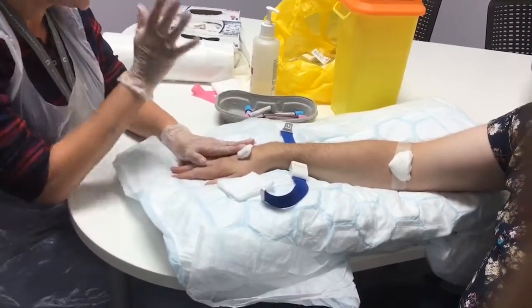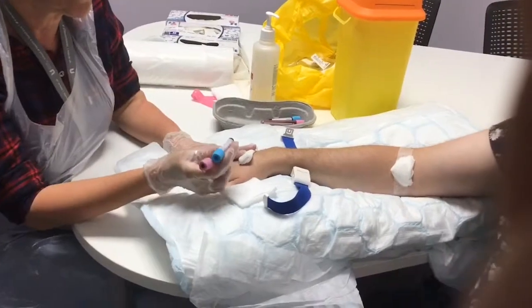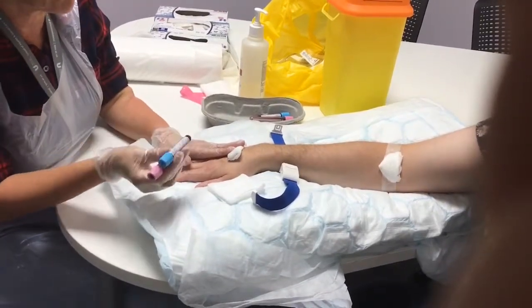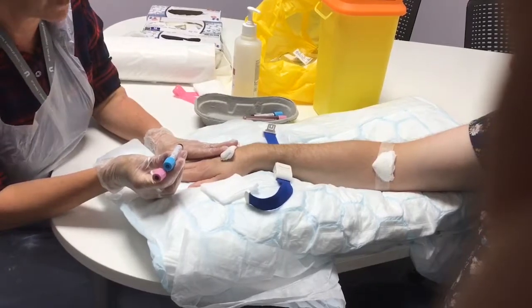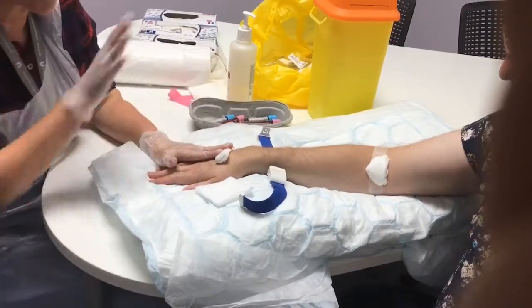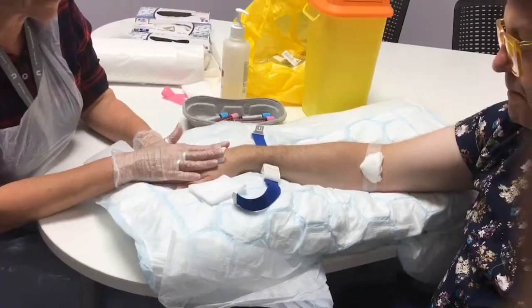Thank your patient and clear all your equipment away. Your bottles must be labeled next to your patient — if this were in practice I'd make sure I had my stickers. If you go to the nurse's station there's a risk you could mix up patients' blood samples, and having to repeat the procedure doesn't do much for your patient's confidence. So make sure you label it by the patient, document it thoroughly because that's your legal requirement, and just reassure your patient and check they're comfortable.